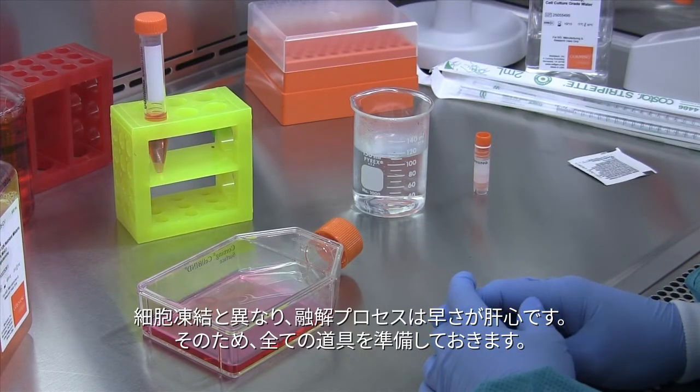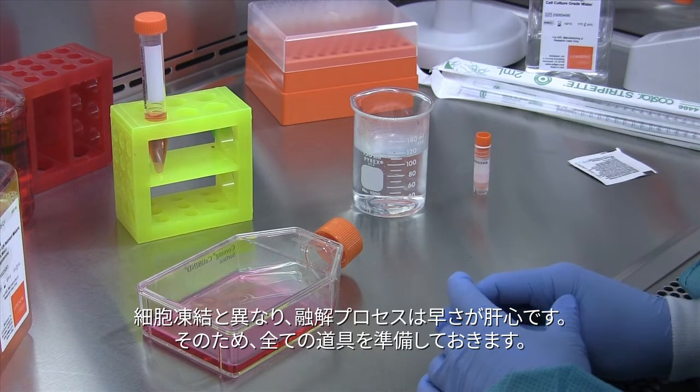Unlike freezing down your cells, thawing out your cells is a rapid process. Therefore you want to have all of your supplies ready.